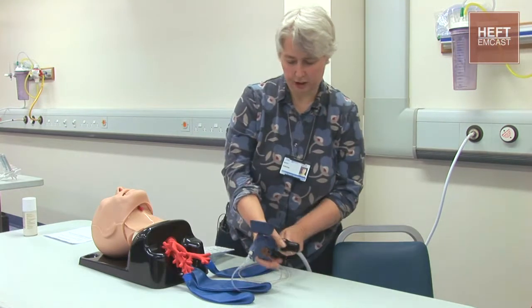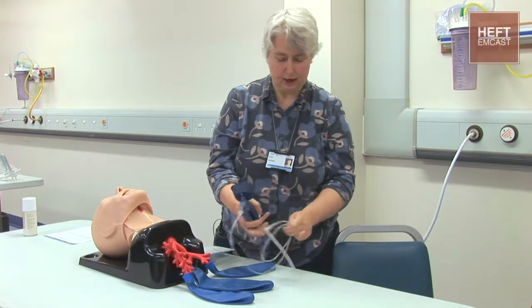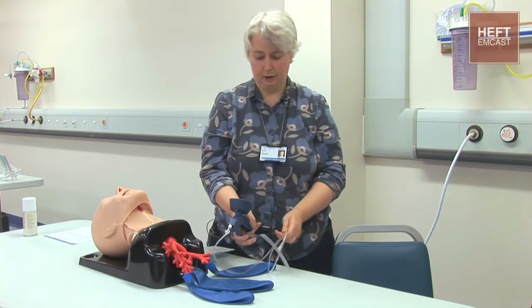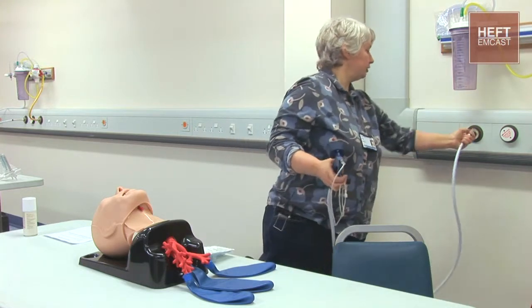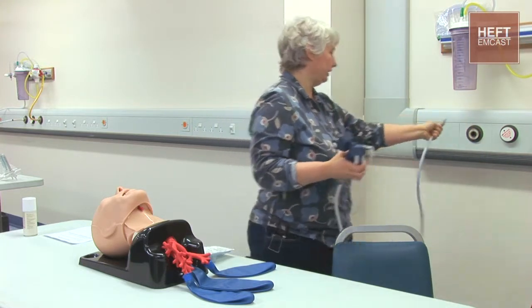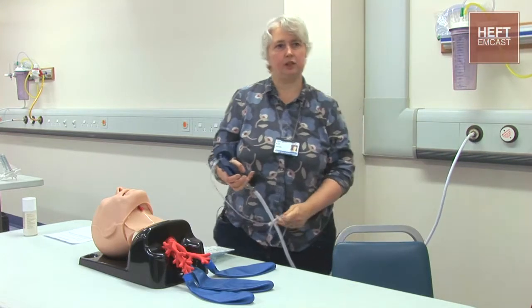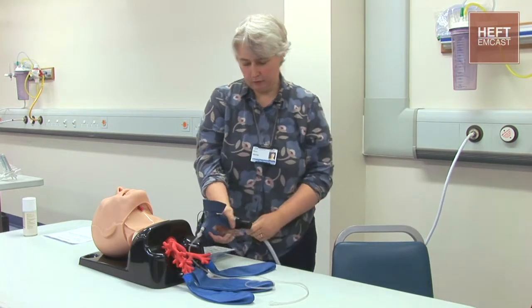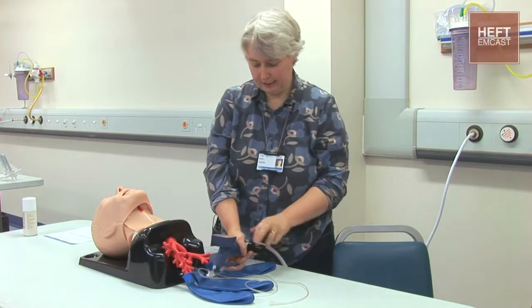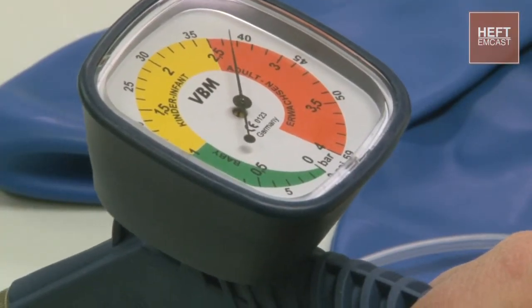First of all I'd like to show the ManuJet. This is basically high pressure oxygen which can be adjustable. It's attached either to the wall oxygen outlet, or there are other versions where you can attach them directly to the anaesthetic machine. If you look at the controls, you can see that it has a green setting, a yellow setting and an orange setting.